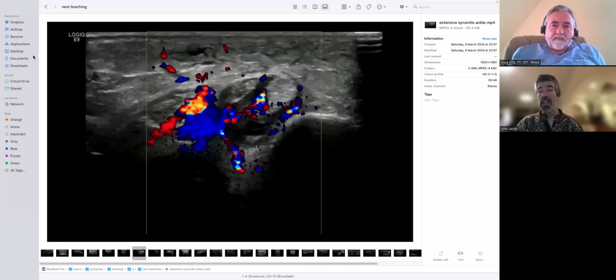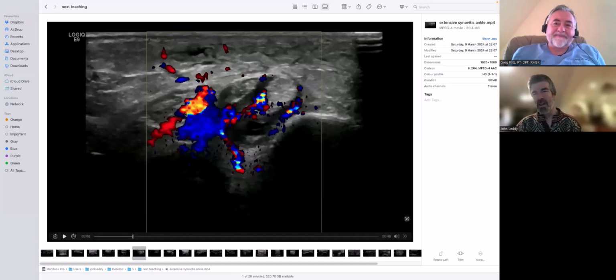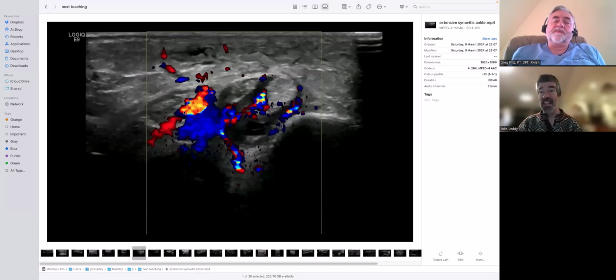What you're doing is when you want to be able to say with some degree of confidence that there is no vascularity, that tends to be when you max everything out. Because in general, when there's stuff to see, you can see it without too much trouble. The difference is that when you want to say that there isn't any there, you then have to go the extra yard, and that's when you're using very subtle techniques. Very slow flow, very light touch.